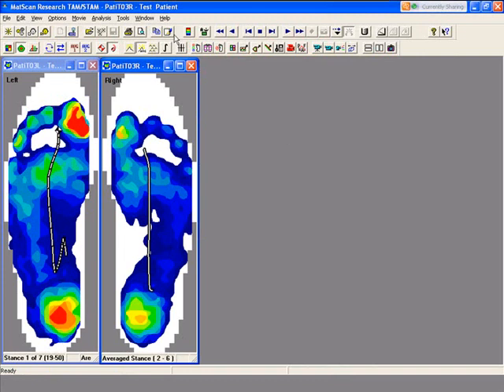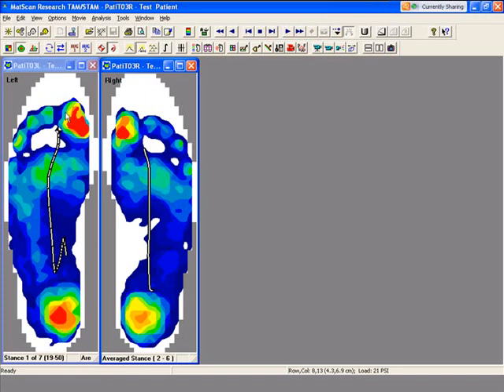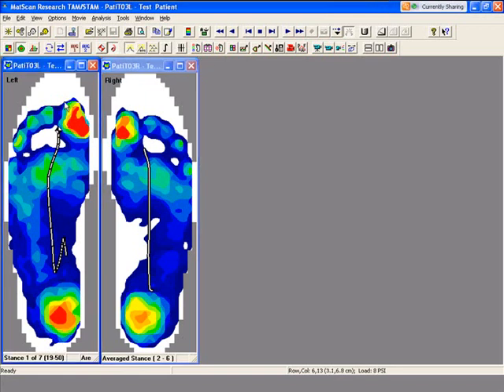We'll keep the middle stances, and now what it's created is an average stance of 2 through 6 and the pressure distributions for those averages. Now we'll click on the left foot and do the same thing.